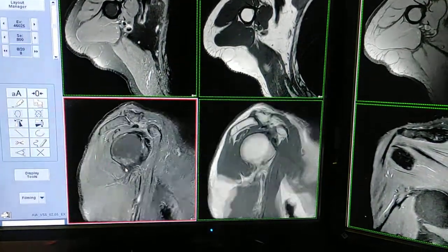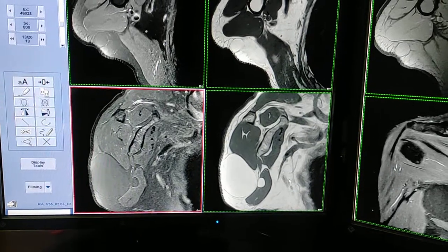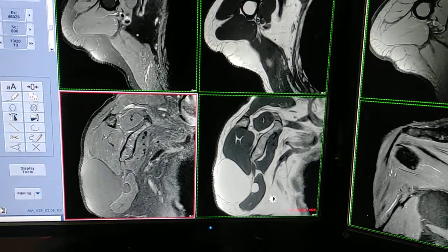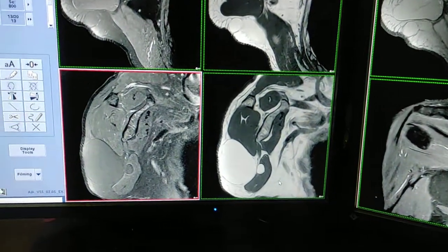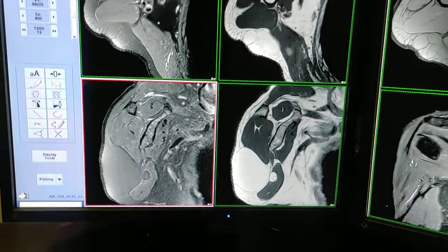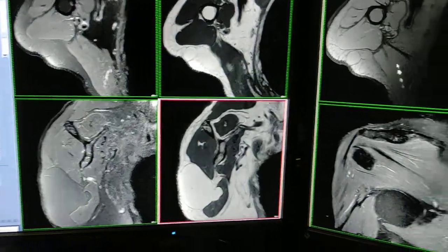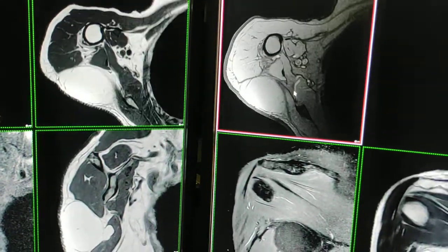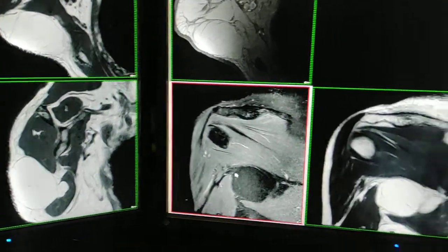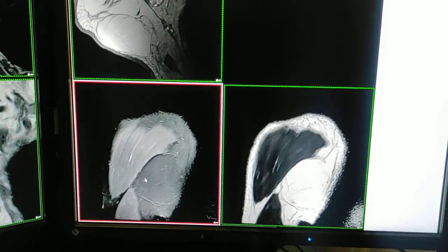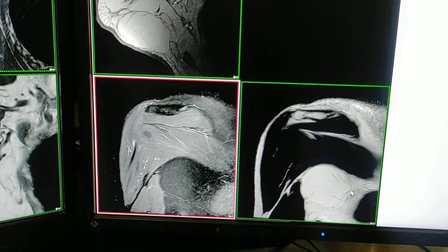This is the sagittal fat-sat PD — this is the lesion, large. This is the T1-weighted sagittal image; it is hyperintense on T1. This is the axial gradient sequence. This is the lesion on coronal fat-sat PD, and this is the coronal PD image.